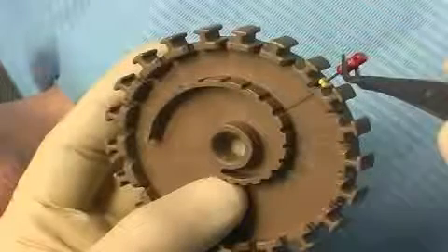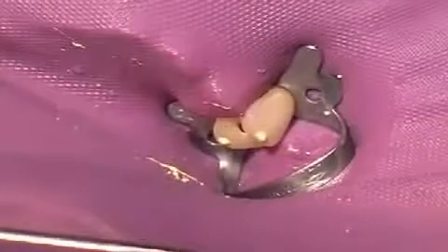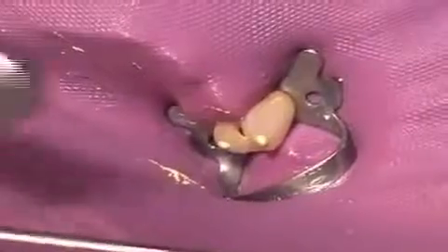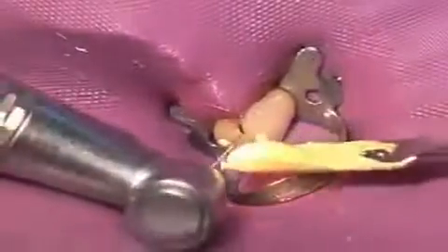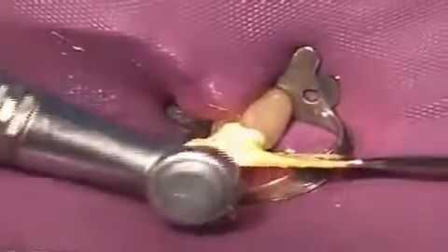If the tooth has a strong foul odor, if pain is experienced, or if there is severe bleeding from the interior of the tooth, then a final filling of the tooth's interior should not be done. In such cases, a medication, the yellow paste seen here, is rotated into the tooth, which is then tightly sealed for a couple of days. However, the temporary sealing material must be absolutely saliva-proof. That's the gray compound seen in the image, as it keeps the tooth tight for about 1 week.